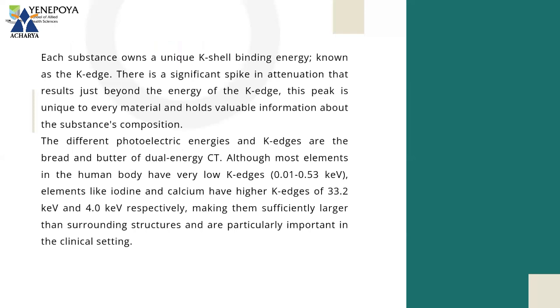There is a significant spike in attenuation just beyond the energy of the K-edge. This peak is unique to every material. Every tissue will have its own K-edge, and it holds valuable information about the substance composition.